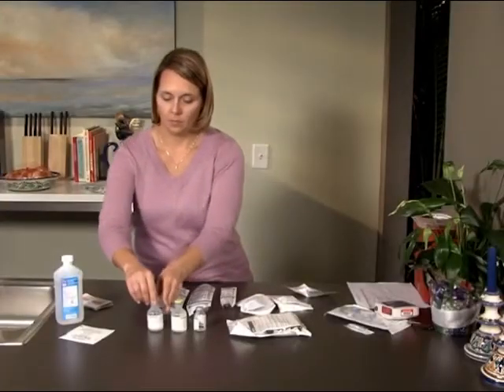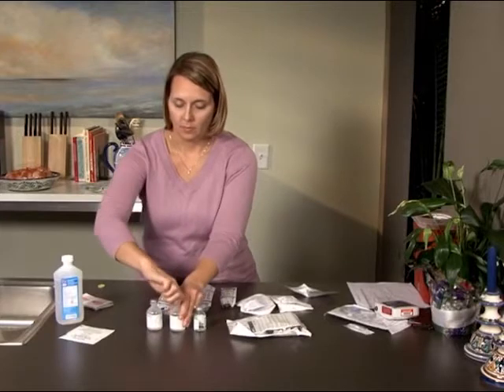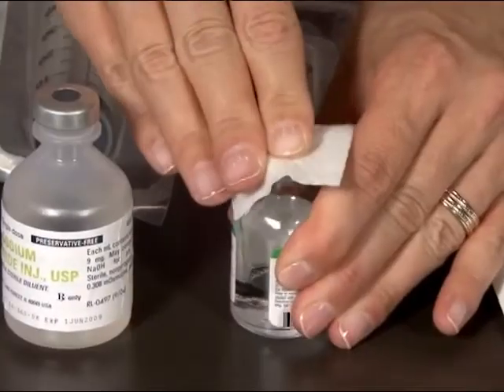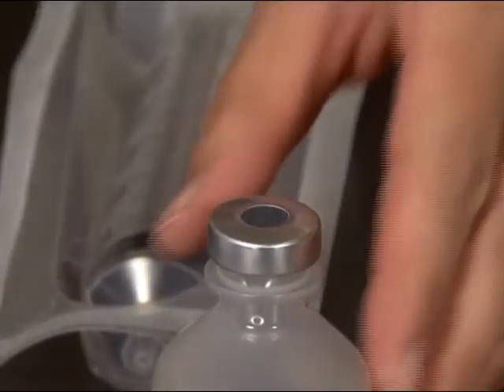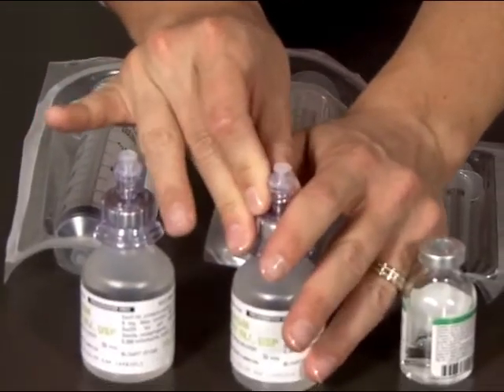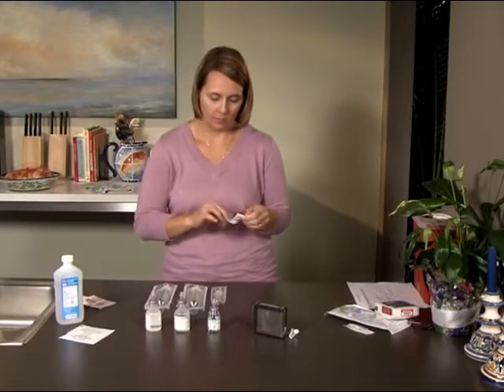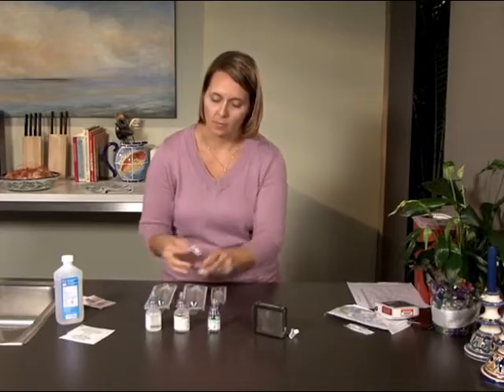Next, take the vial of Remodulin and remove the plastic cap. Do the same with the vials of sterile diluent. Open an alcohol swab and use it to clean the rubber stopper on each of the vials. Take one of the vial adapters and push its spike into the rubber stopper of the Remodulin vial. Repeat the process with the other vial adapters and the vials of sterile diluent. Using an alcohol swab, clean the rubber stoppers on the vial adapters. You are now ready to begin mixing your medication.